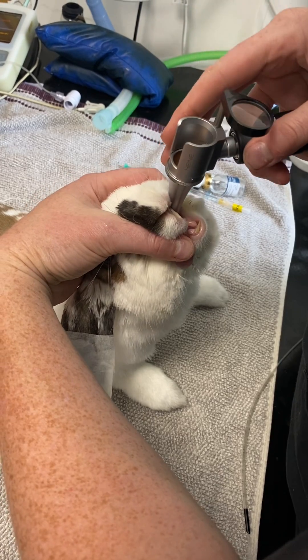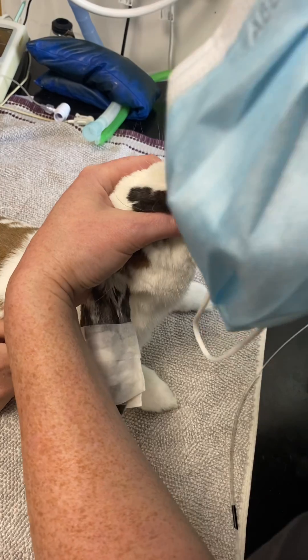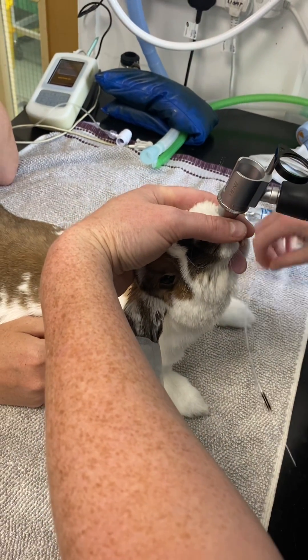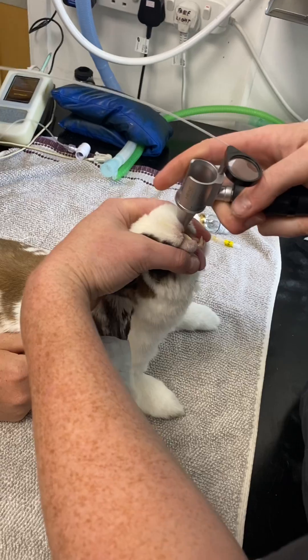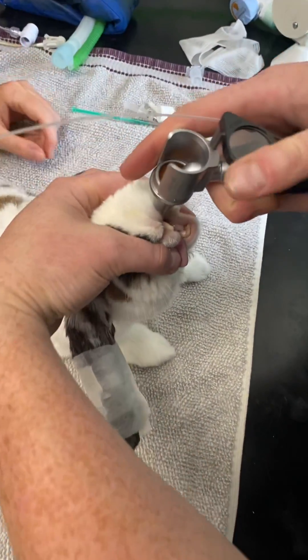Typically the soft palate is over the top of the epiglottis and you can't actually see it. Sometimes what I do is blow a little bit down there — that can flick it off. Sometimes we just need to pop the endotracheal tube down there just a little bit to pop it over the top of the epiglottis. You can actually see the airway down the bottom of the otoscope — that black hole down the bottom is the airway, and you can see the epiglottis moving.